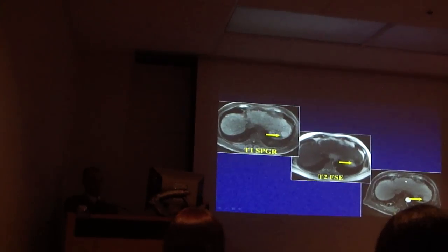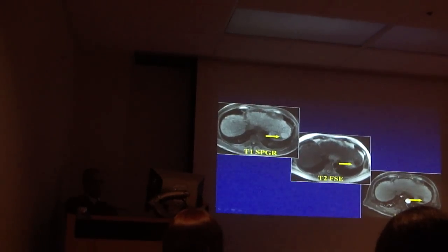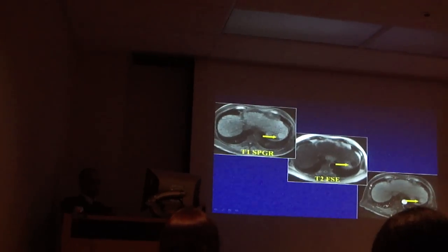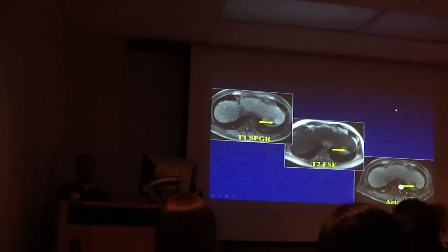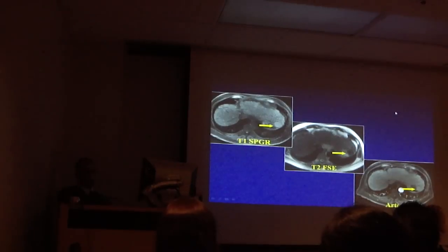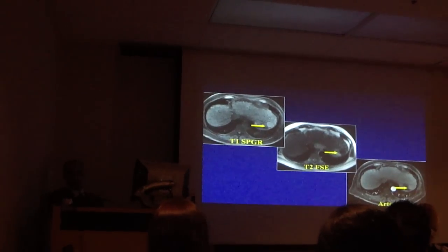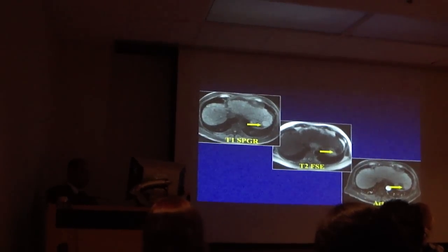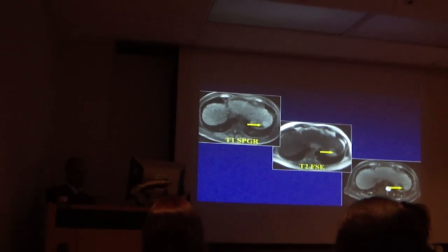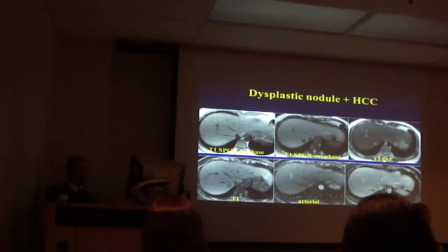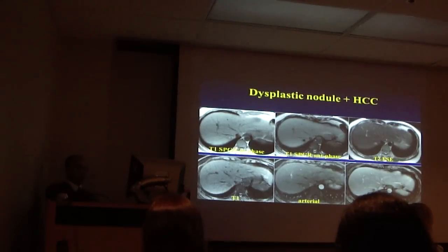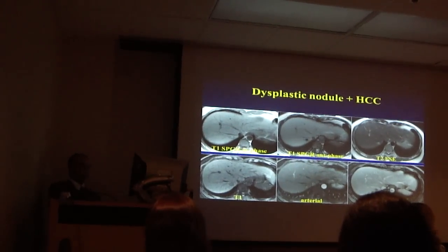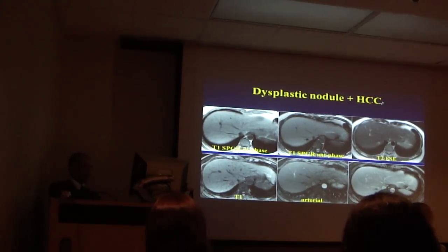On arterial phase, everything becomes iso-intense and does not demonstrate washout. This is, by definition, a regenerative or a dysplastic nodule — this is not an HCC. It does not demonstrate washout. Let's go to what a dysplastic nodule plus an HCC looks like.